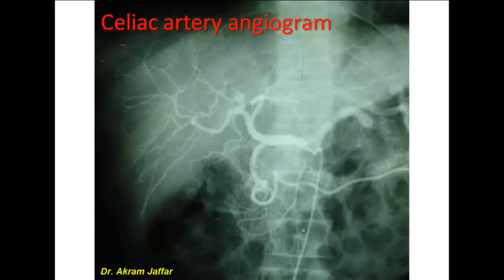This is a celiac artery angiogram. You can see here the catheter that has been passed from the femoral artery into the abdominal aorta — it reaches the abdominal aorta from the femoral via the external iliac, then the common iliac. This is the site of the catheter, and a radio-opaque material is injected into the celiac trunk.